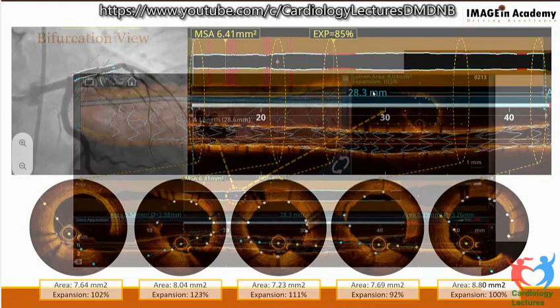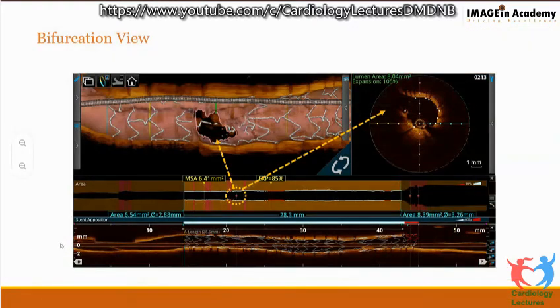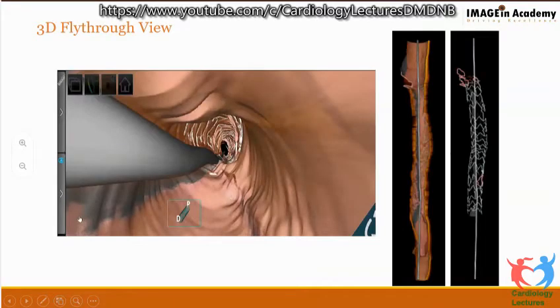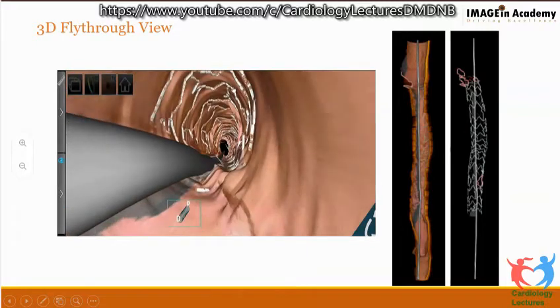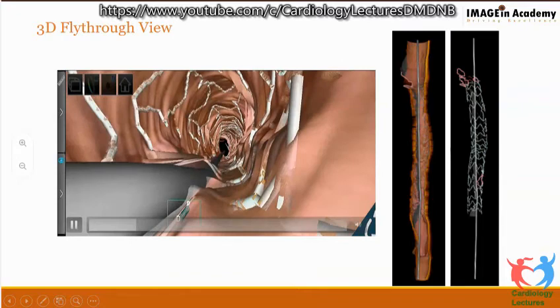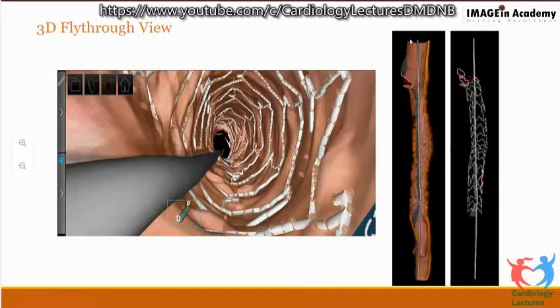We also looked at the branches. There was a diagonal which was coming out, and the early indication is that there are not too many struts across this diagonal, which is very optimal. And this is a fly-through view. A lot of operators are fond of this view, which, if it all appears white, that means the stent is apposed, and where it is not, it will appear red in color. So you can tell where the stent is apposed or not.